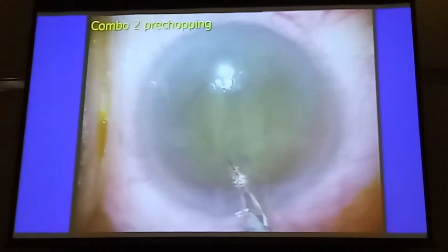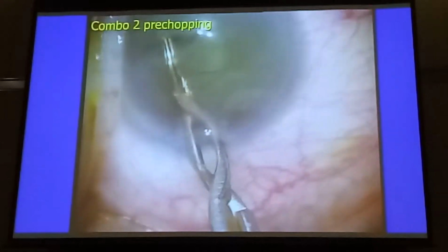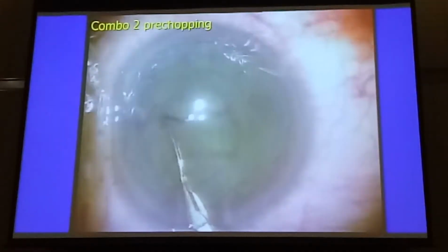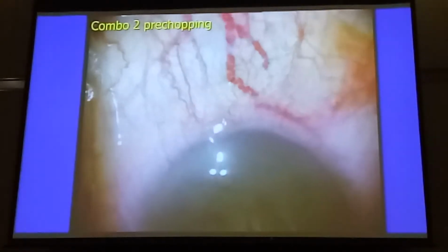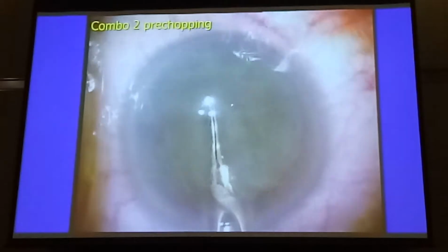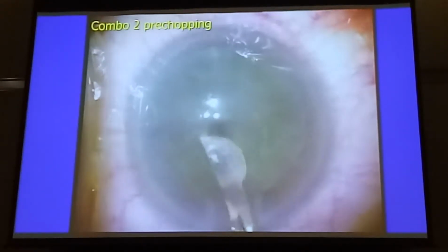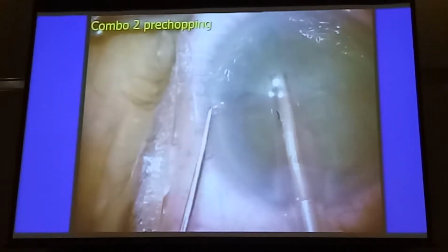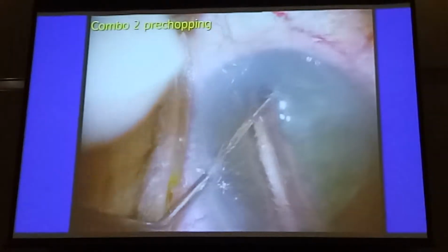So the nucleus has been halved, and then you use that to rotate. That's why hydrodissection is important. You want to be able to rotate this nucleus 90 degrees, and then we'll do the second division. Proximal half is done, distal half is done. So that's 4 quadrants in 30 seconds with no expensive femtosecond laser. I told you I'm a poor surgeon, right?